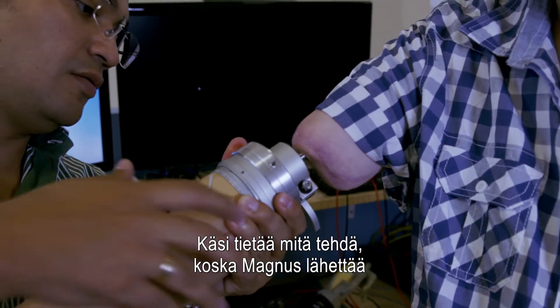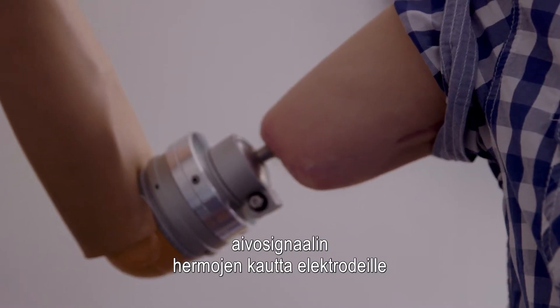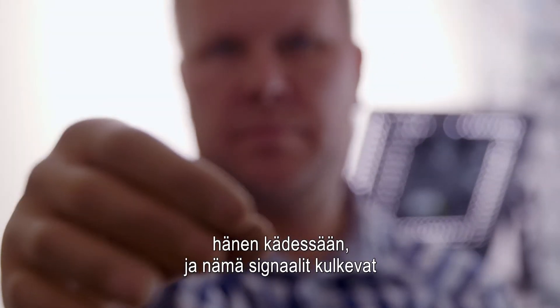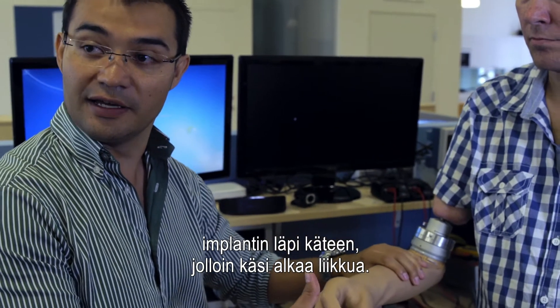The way this hand knows what to do is because Magnus is sending a signal from his brain to the nerves, to the electrodes that are implanted on his arm. And those signals travel through the implant to the hand, and then the hand activates.